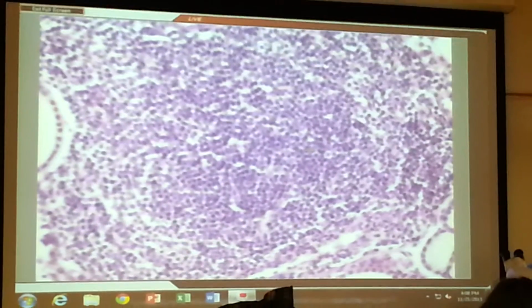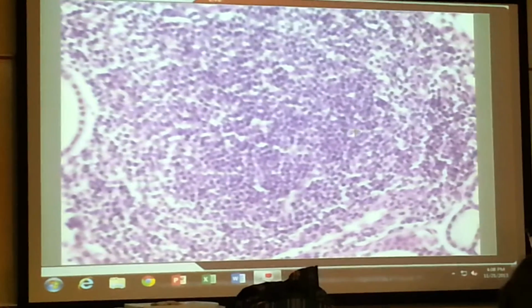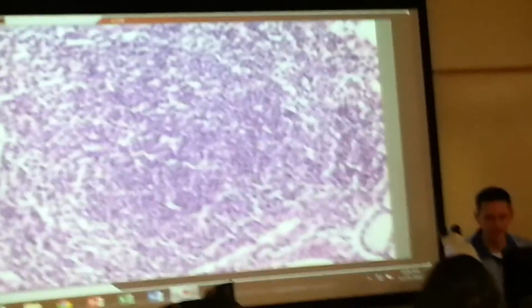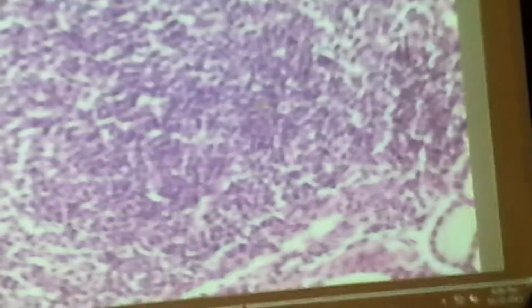And the oxyphil cells are going to be a little bit bigger and a little bit clearer, so I think there's a pretty obvious one right there. You see that sort of white space around it, out of the nucleus. So that is an oxyphil cell. So these bigger, clearer cells are oxyphil cells. Most of the cells are chief cells.